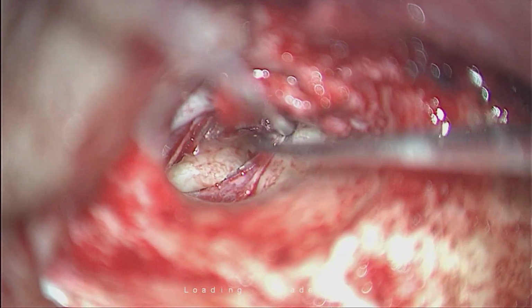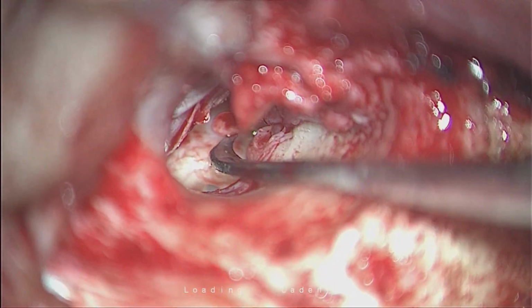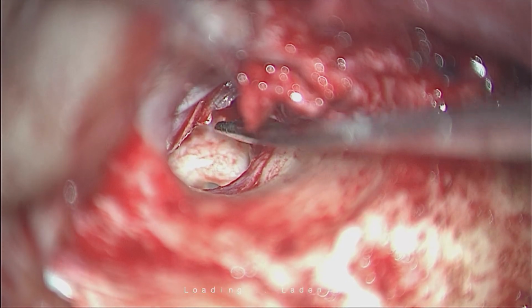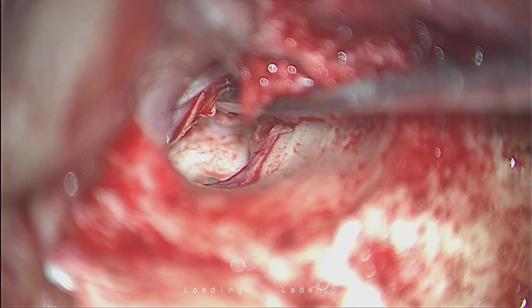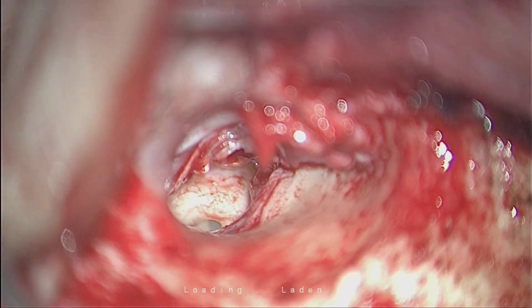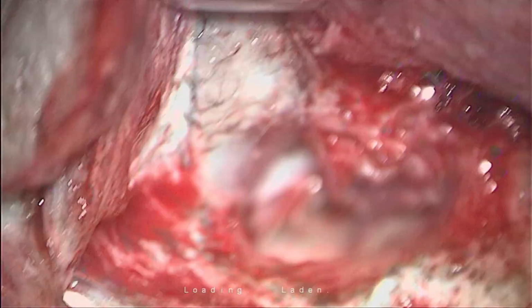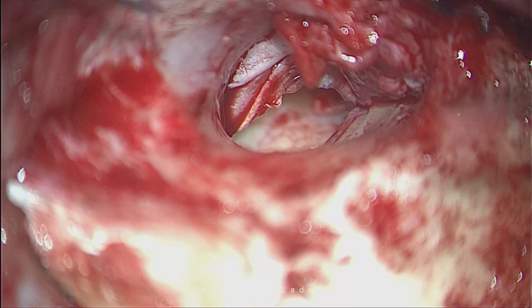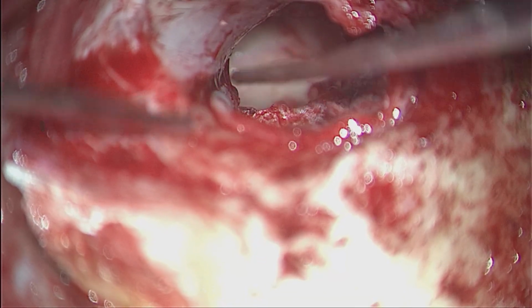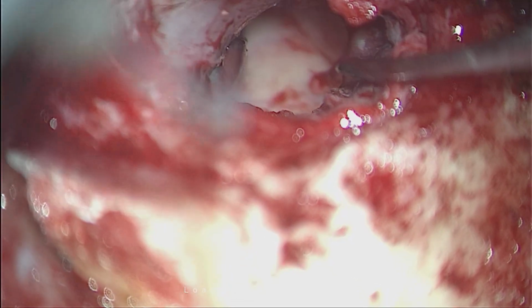Now see, this is the ossicular chain. And see what I am doing simply: checking the continuity. See the mobility of the incus and the stapes. And you can see even the glimpse of the round window, so prominent. So we have seen the middle ear, we have raised the flap, we have seen the ossicular chain, we have flushed the eustachian tube area, and all look perfect, and the bed for the grafting is ready.